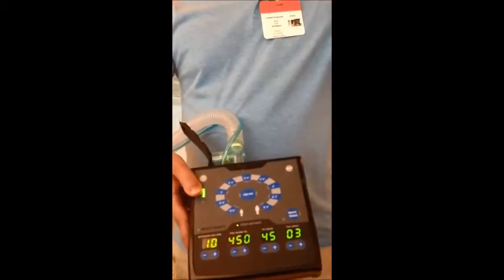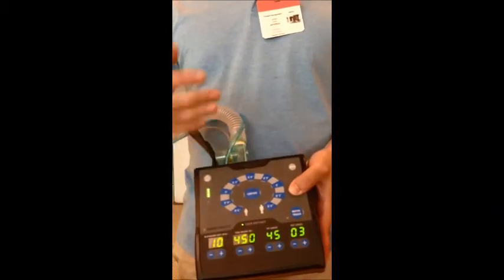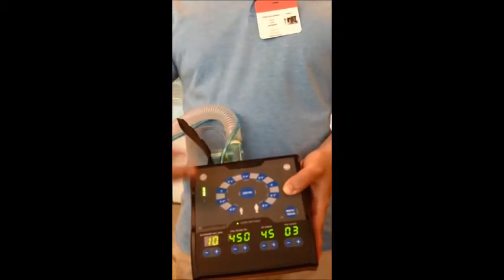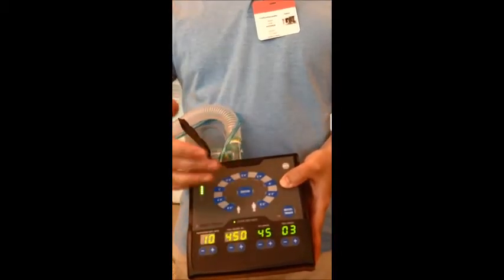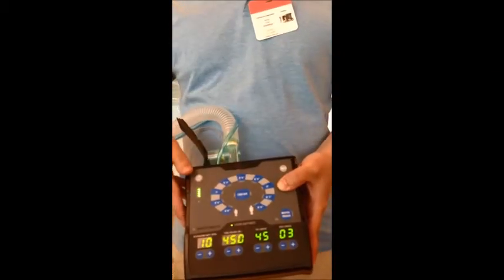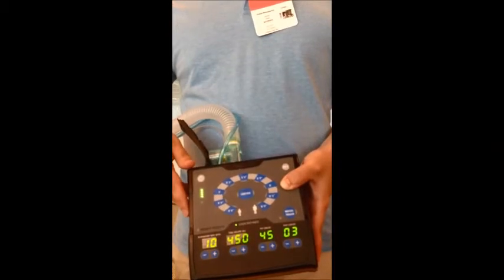In terms of the type of patients it can see, it can be anywhere from respiratory failure all the way to influenza and ARDS-like symptoms, especially when dealing with MERS. And so if that is a situation, you can easily adjust the peak inspiratory pressure to be able to adjust for those higher airway pressures that those patients are seeing, as well as increase PEEP if necessary to be able to ventilate those patients adequately.